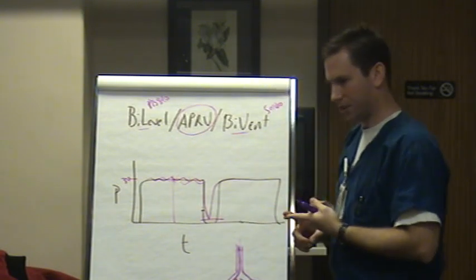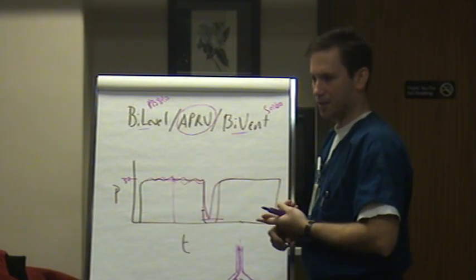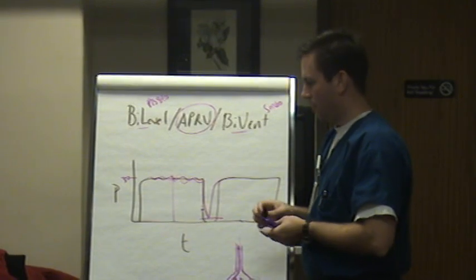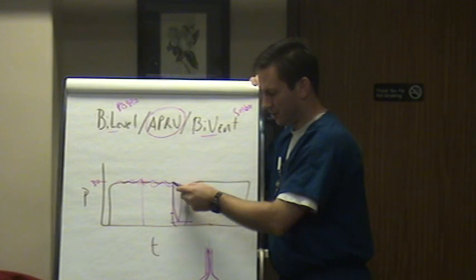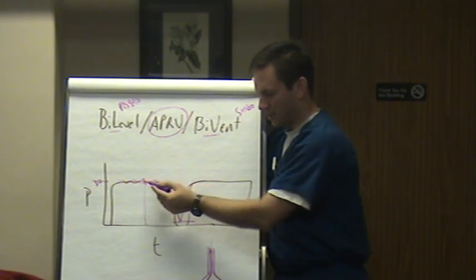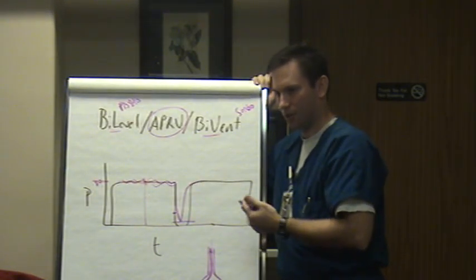So if you have a CO2 issue with a patient who is in PRVC and you got their rate crazy high, I would move to this, and that way it's a win-win. You can definitely get their PO2 fixed because you got all this mean, and let them fix their CO2. So the more we use it, the less we're gonna use oscillators, I think, because oscillator doesn't have to have a dump because it breathes so fast. It breathes 600 times a minute, so CO2 is not an issue. Whereas this, if they're breathing 60 times a minute, we're still going to have a dump so that we can get an expiration, if you will, of CO2 so they can clear that.